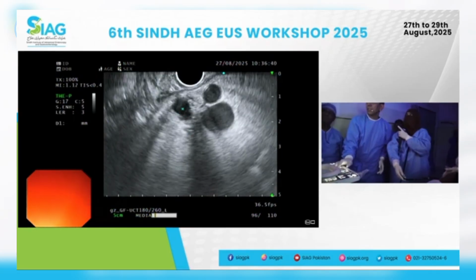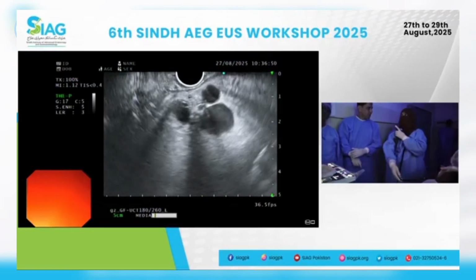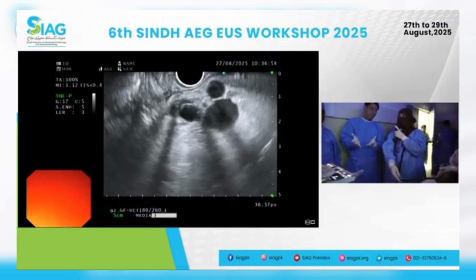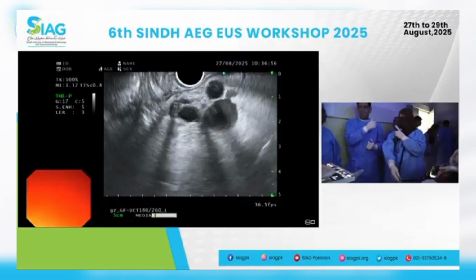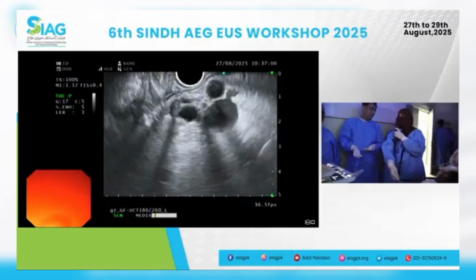So measure this. Why are we not seeing the pancreatic parenchyma? Because it is too much dilated, no? नहीं, उसकी वजह ये है कि there is an atrophy of the pancreatic parenchyma in a chronic process. Good, excellent. So in a chronic obstructive process, you'd expect atrophy of the pancreatic parenchyma.